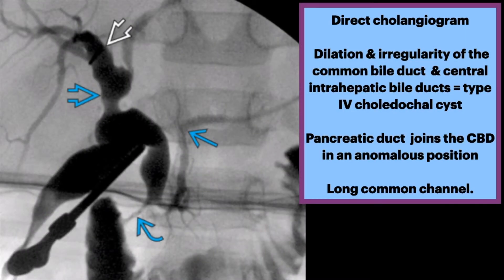In this separate case, a direct cholangiogram shows dilation and irregularity of the common bile duct and central intrahepatic bile ducts, consistent with a type 4 choledochal cyst. The pancreatic duct then joins the common bile duct in an anomalous location, creating a long common channel.